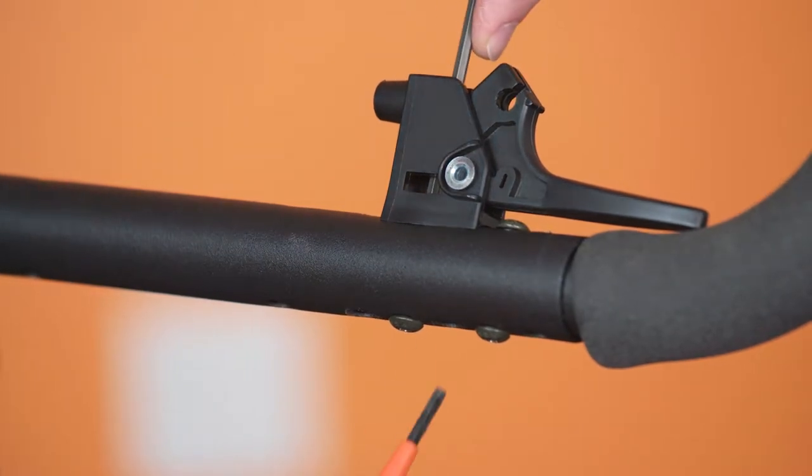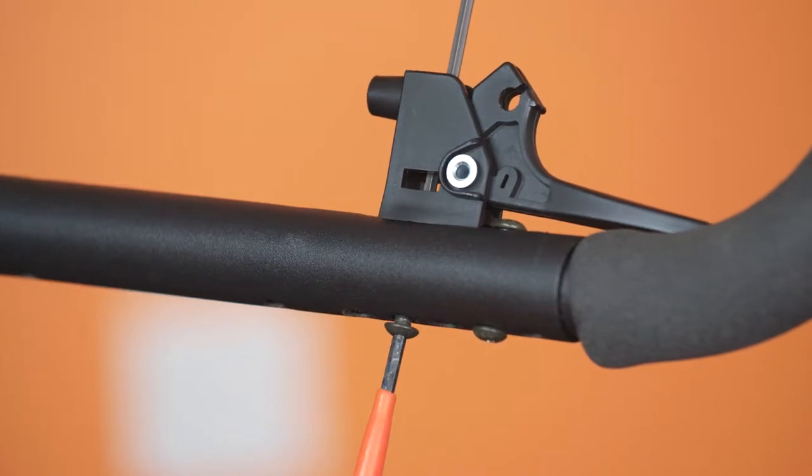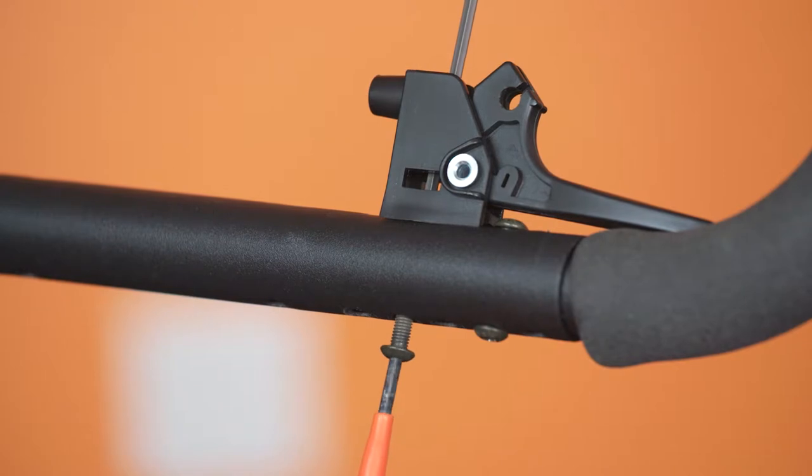Pry the cable away from the push bar or back tube, then using the trigger handle, pull the cable sheath fitting through the mount. Then slide the cable termination out of the trigger handle.